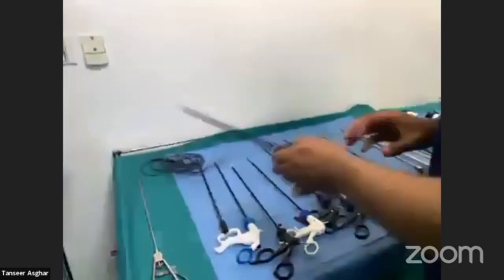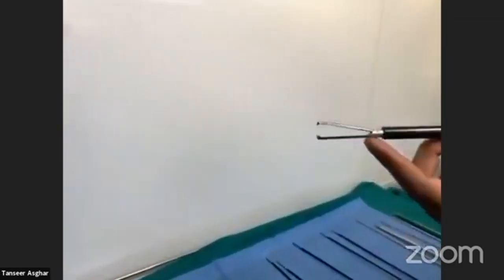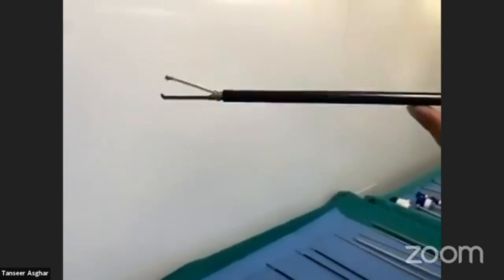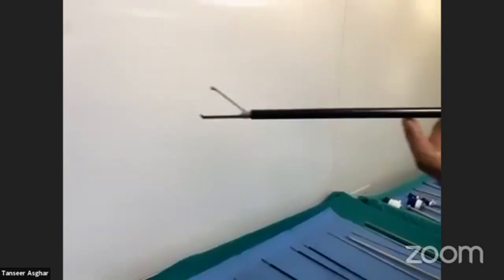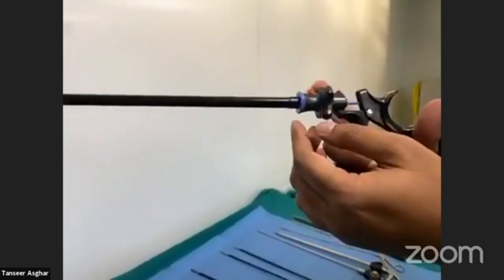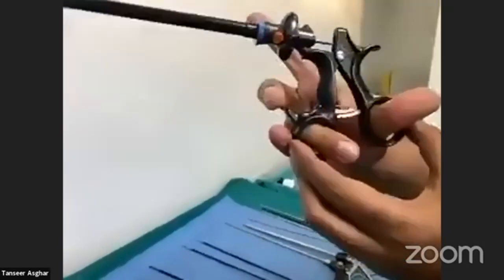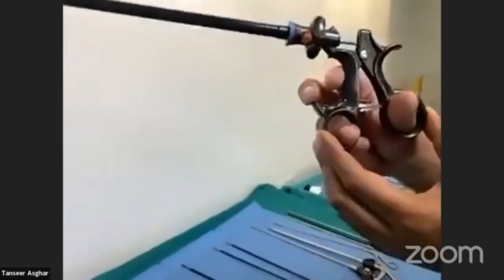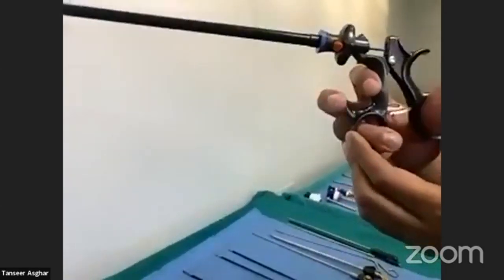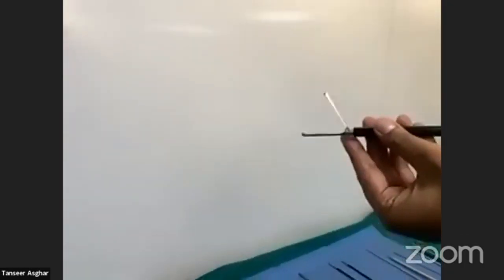This is another important instrument — it is an extractor, a grasper instrument usually used for extracting the gallbladder. It has a rotating shaft and a knob to rotate it, and can be locked. Most people use it locked. It is usually called the crocodile because it opens its mouth like a crocodile.